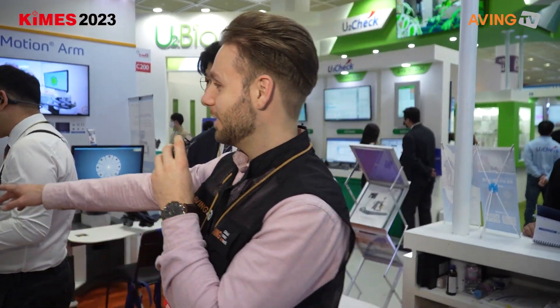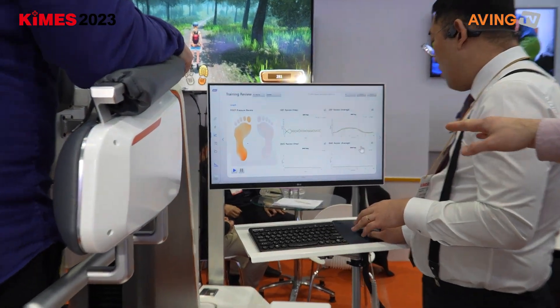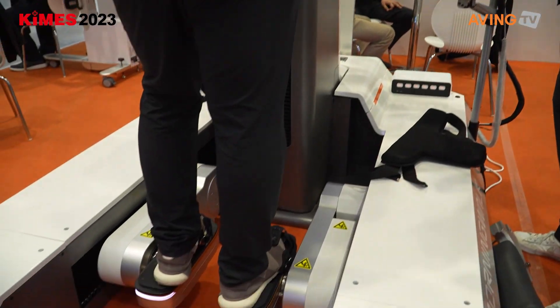As you can see, it's also monitoring the feet and all the digital information from his feet right now. So you can see how much pressure he puts on the left foot, the right foot, or even on different parts of his feet as well.